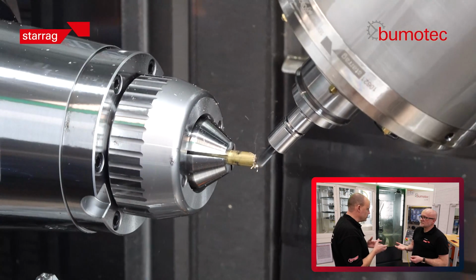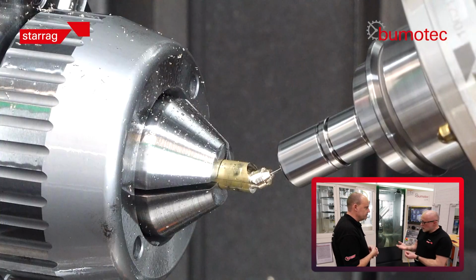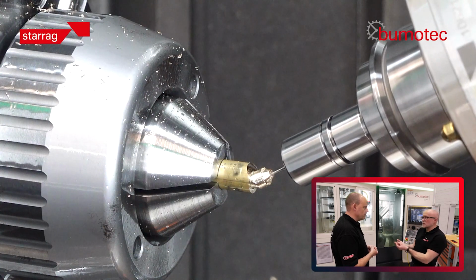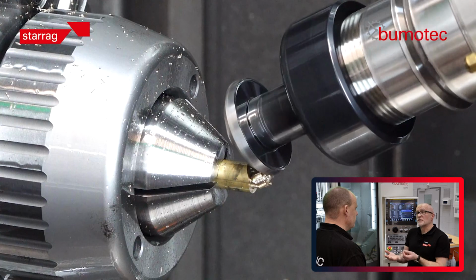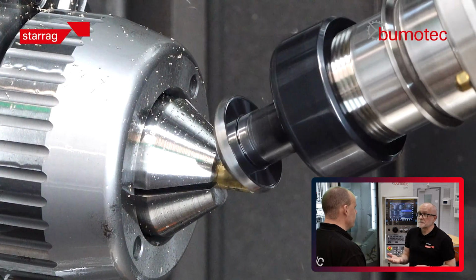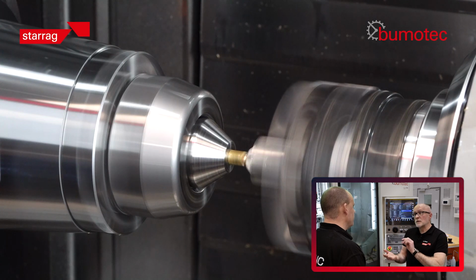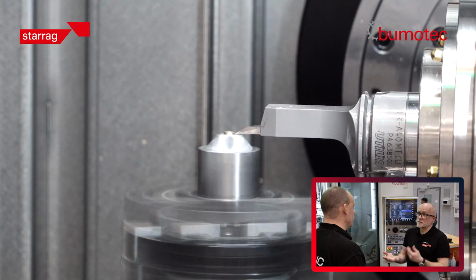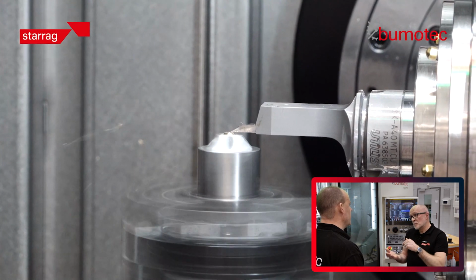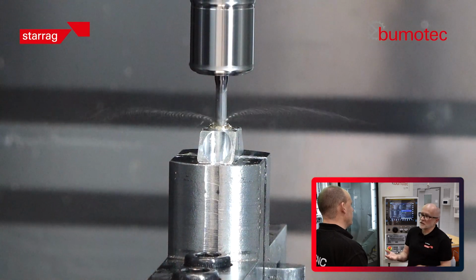They're very small parts, so what are the challenges machining these? Well, for a start, we're talking about a small bar. So we feed through the spindle with a bar, and we produce the first half of the component. We then bring up a sub-spindle to connect with the finished end, part off, tip the sub-spindle up to the vertical position and complete the component, and then we have various ways of extracting the component, either ejecting it onto a conveyor or picking it up into a tray.